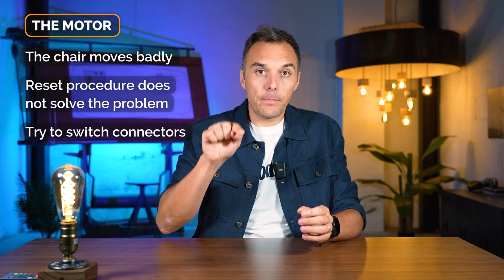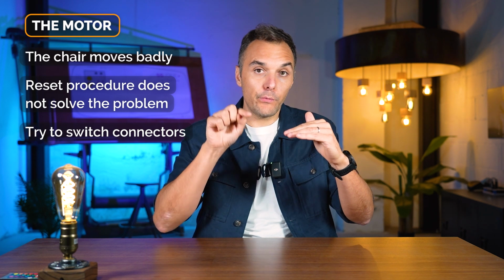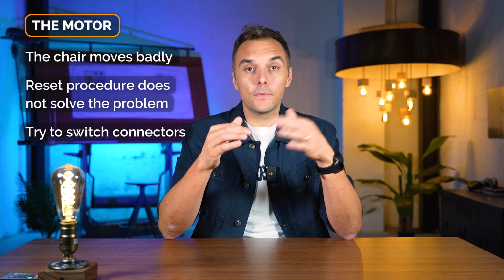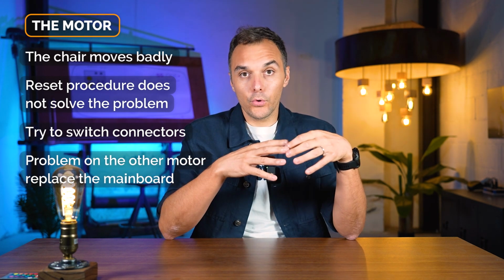Normally when we press the upper button we move the motor of the chair, but if we switch at the base, when we press the upper button we are now moving the backrest. So we can see immediately if the problem just transferred to the other motor. In that case, it is the main board that has the problem.